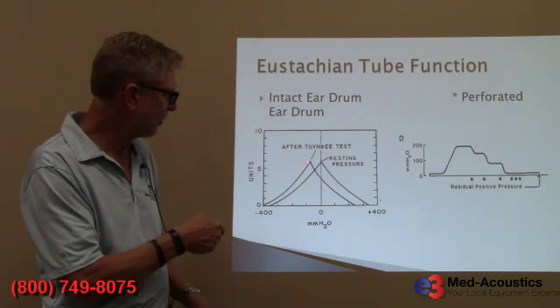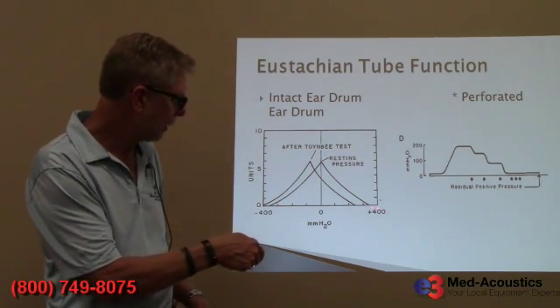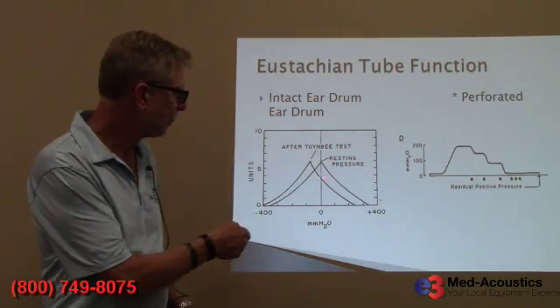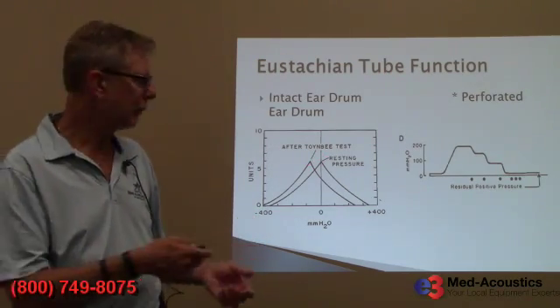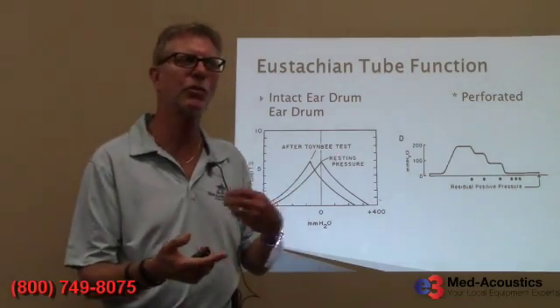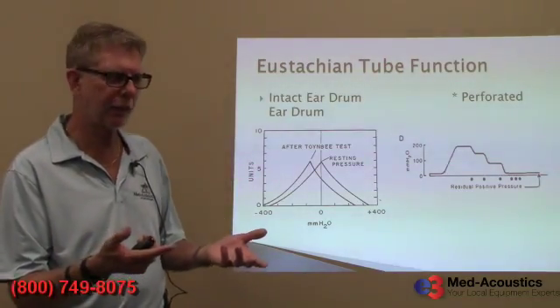And you get a positive tympanogram, right? Maybe one even more positive. And then if you have them drink some water after that, the pressure will go back. It'll be more negative. And you'll see a separation between the two. And when you do have a separation between the two peaks, they pass. If they're superimposed, and you try this several times, and they're superimposed, well, the Eustachian tube isn't working.